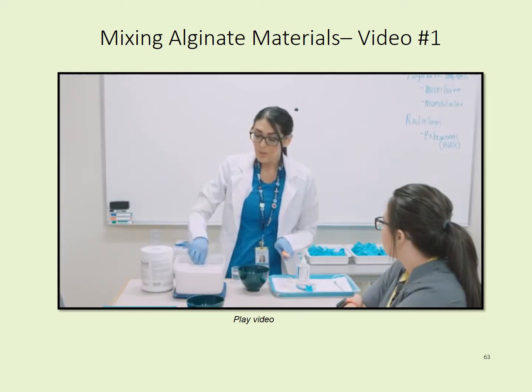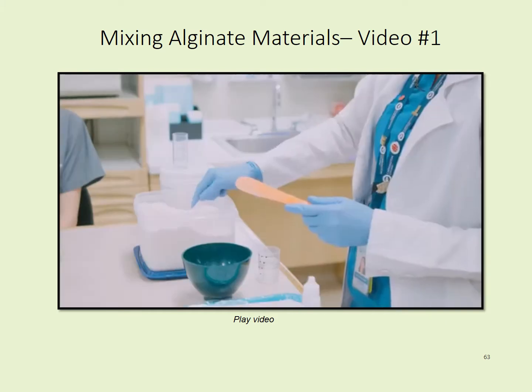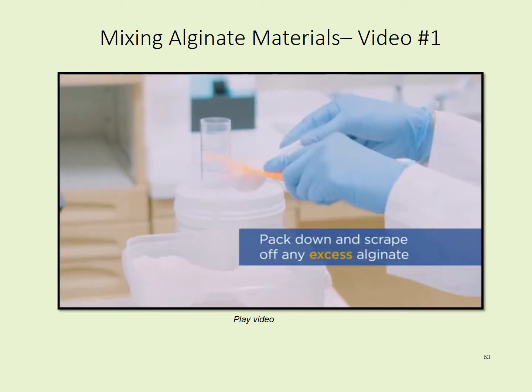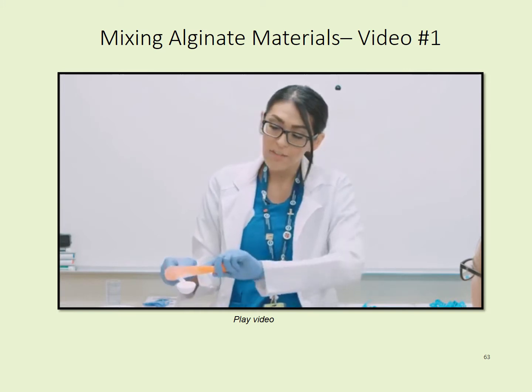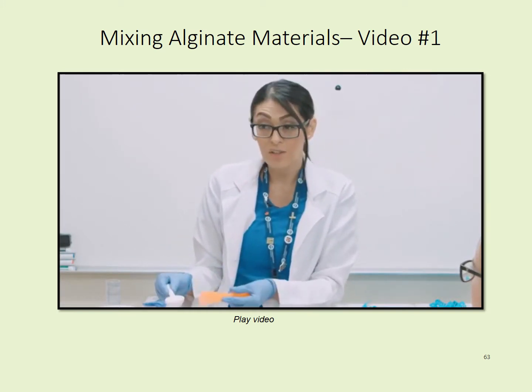So what we're going to do is when we measure our alginate, we want to be sure that we scoop the alginate and we pack it down with our spatula like so, okay? And we kind of even out the scoop. Because if we're measuring 2 scoops of water and we have a heaping scoop, then the alginate is going to set faster because there's not enough water.